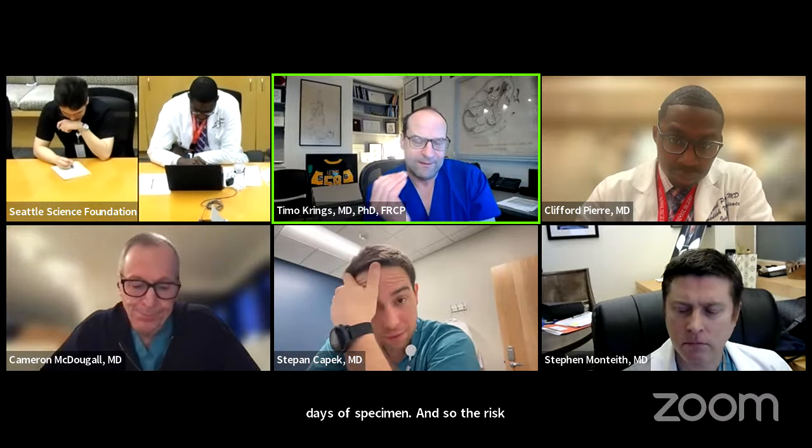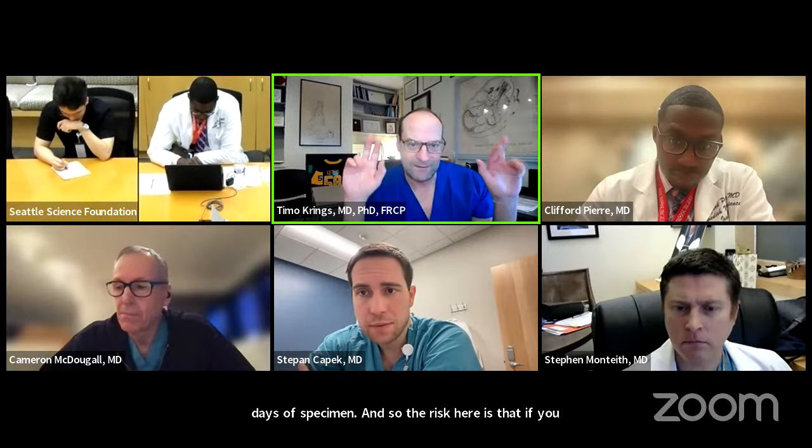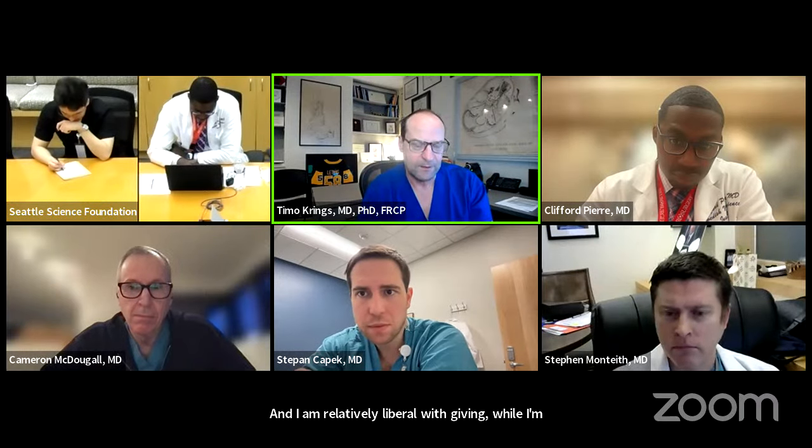And so the risk here is that if you don't know that you are in vasospasm, you may think you are in a wedged position. And that is a major risk. So you have to be very careful when you're going into the vessels. And I'm relatively liberal with giving verapamil, while I'm slowly going into the vessel, with small puffs into the vessel so as to prevent local vasospasm.